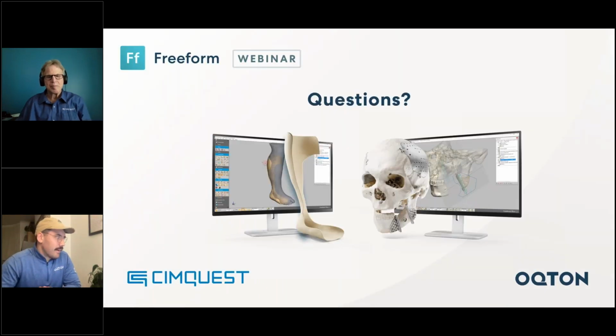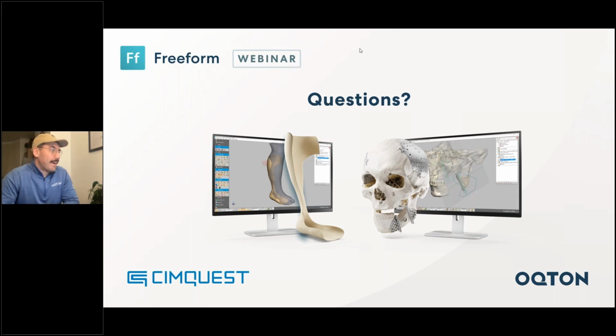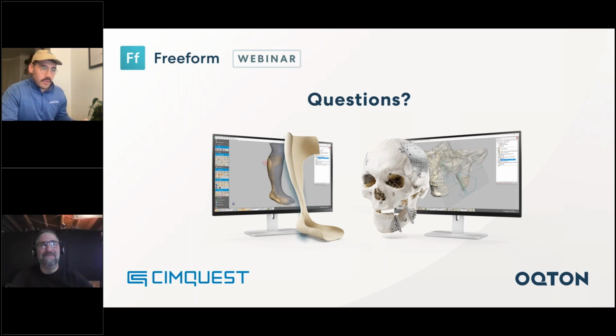Really interesting. I always love to watch Freeform webinars. It's great to see how easily Dave can use that haptic device, even though there are the hiccups associated with live demonstrations. We have some questions here. If you've got any other questions, we've got 13 minutes, so feel free to drop them in and we'll get through as many as we can. If we don't get to your questions, then we'll follow up afterwards to make sure that you get the information that you need.